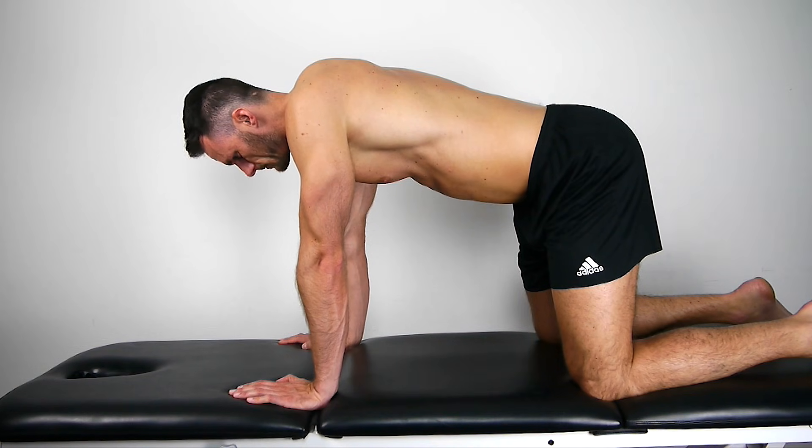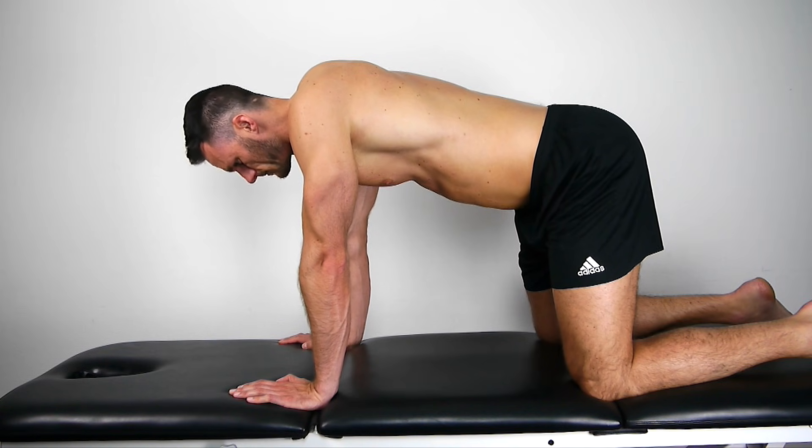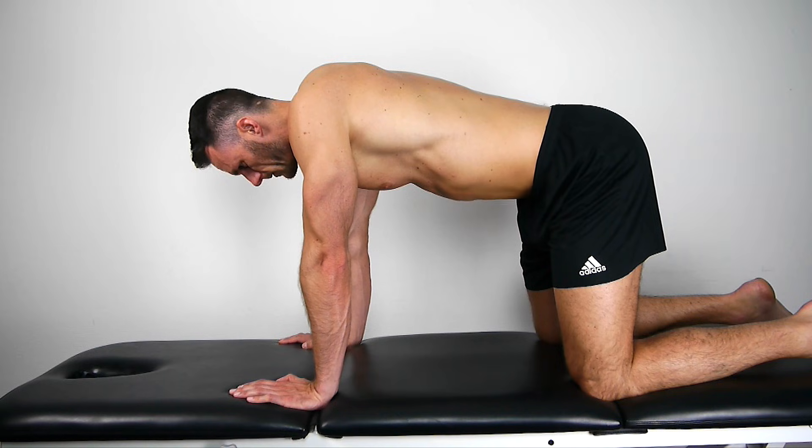You will start in four-point kneeling position. Instruct the patient to keep a neutral spine and then relax the abdomen completely during a deep exhalation. During the exhalation they should then try to pull the navel towards the spine.